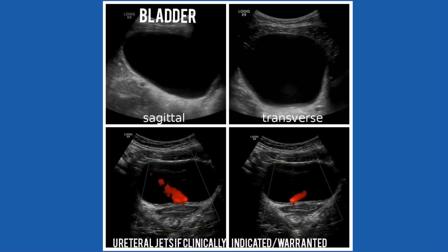For starters, I begin with the bladder. Take sagittal and transverse images, also parasagittal to the right and parasagittal to the left. On the bottom of those two images are the ureteral jets, on the left and right.